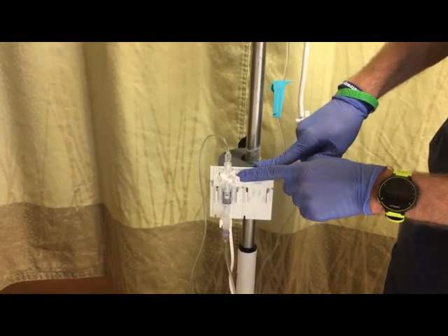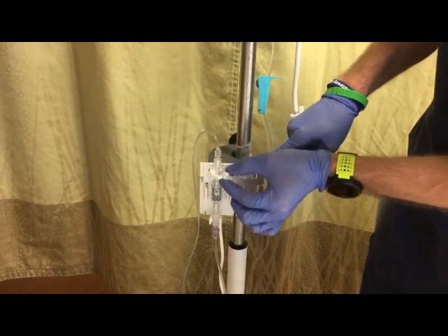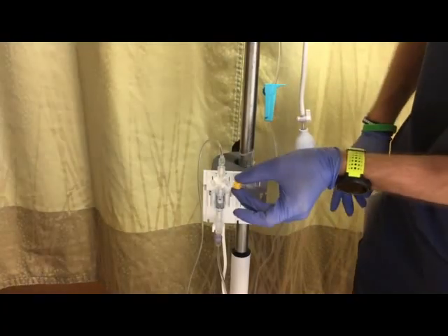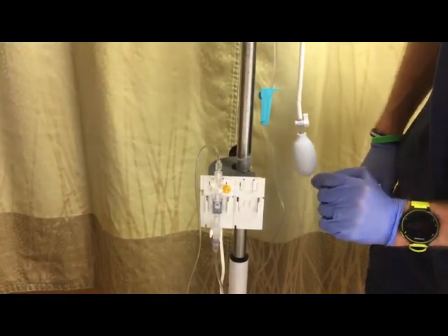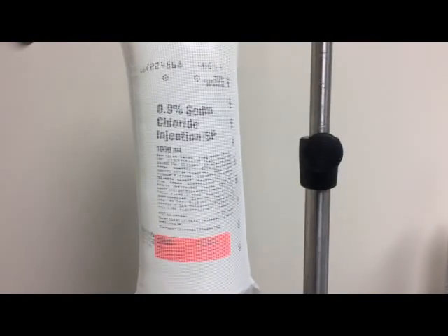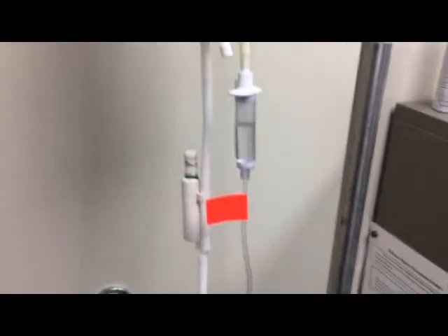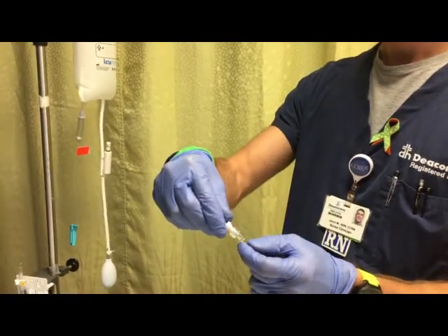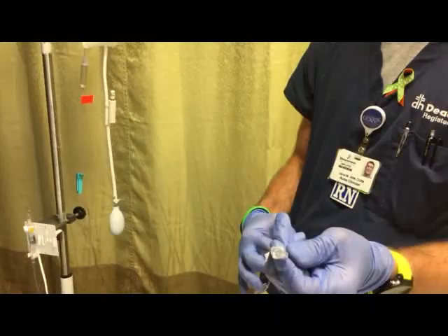Finally, we want to change the white open system cap. This cap's only purpose is for easy priming and actually has a hole in it, so we're going to remove that and apply a yellow dead-end cap so fluid can no longer get in or out of the air-fluid interface. Keep in mind that the arterial line system is considered a continuous infusion — both the fluids and the tubing will need to be changed on Wednesdays and Saturdays. Now we can remove the white cap from the end of the tubing and hand it to the provider to hook to the patient's arterial line.